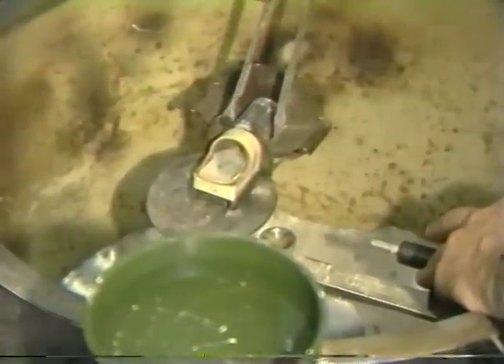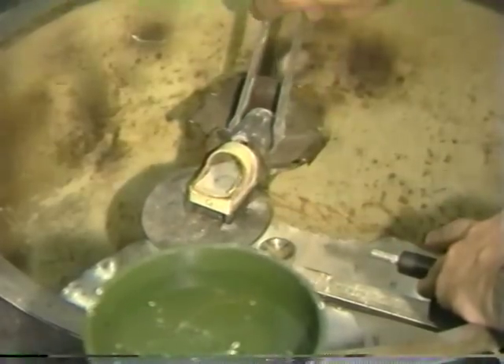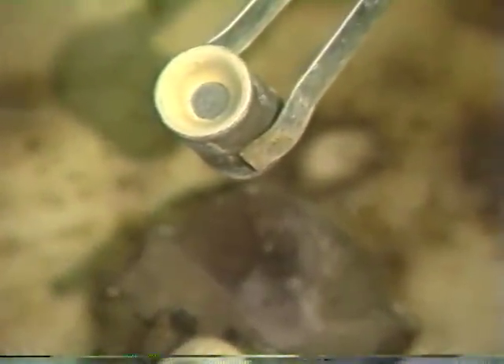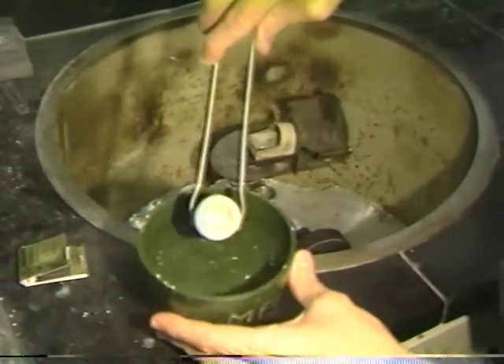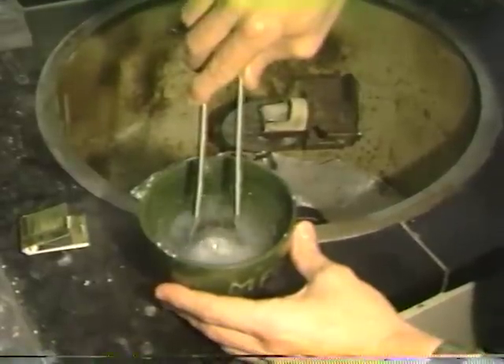Once the machine has come to a complete stop, the tray is pulled forward and away from the ring. The ring is removed and inspected to make sure that we have a proper button. The ring is then quenched in some water — make sure to hold a rubber bowl underneath, simply because you want to be able to retrieve the casting.